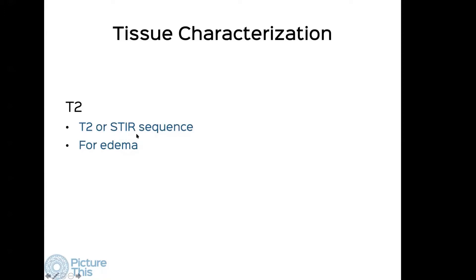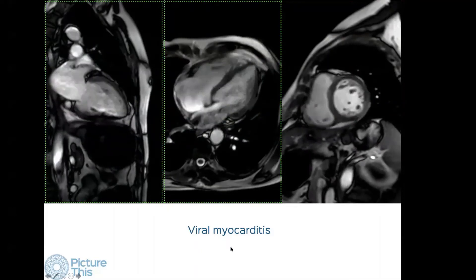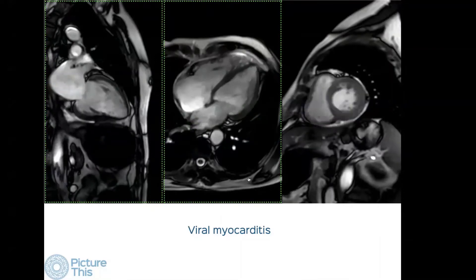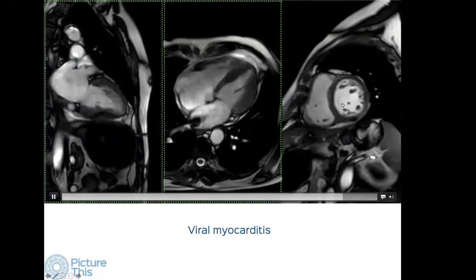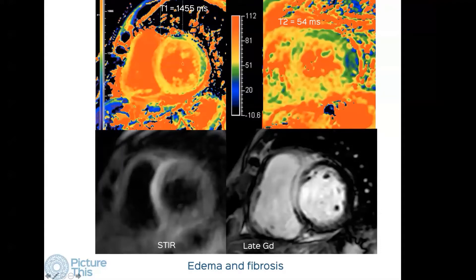We also do T2 mapping and sometimes the STIR sequence. T2 mapping is used to look for edema. Here is a patient who presented with what looked like an acute coronary syndrome — the catheter angiogram was normal, there is mildly reduced systolic function, T1 was high, T2 was high indicating definite edema, and we found late gadolinium enhancement in the anteroseptal segment. So there is edema and fibrosis both. On follow-up after three to six months we can assess residual fibrosis and reduction of edema.